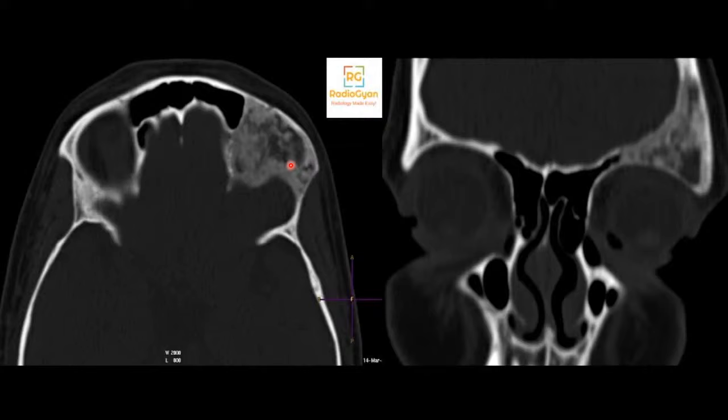These are benign lesions, and the reason I mentioned this is that if you do MRIs for these lesions, they can have all kinds of weird appearances, and you may end up recommending a biopsy for these. So just be careful. If you see this typical ground glass appearance, it's a fibrous dysplasia, and no further investigation is necessary. So what are the differentials for lucent or lytic bone lesions? Does anybody know the mnemonic for that?